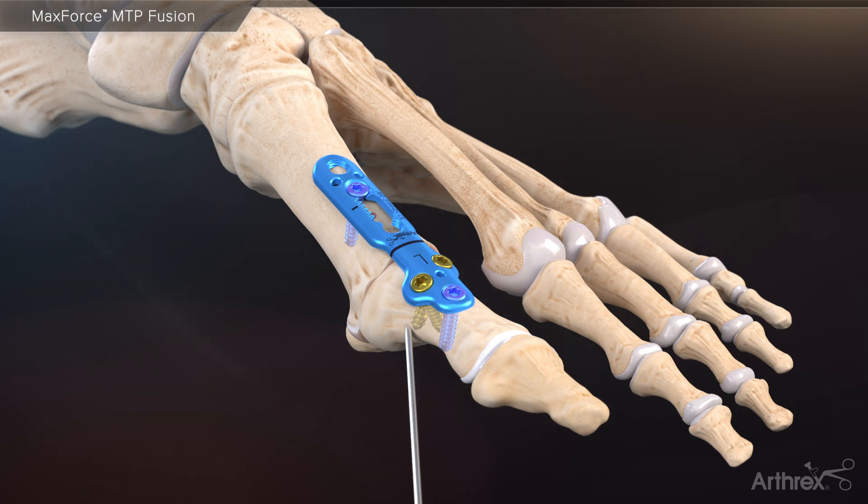At this point, proceed to drill and implant the remaining 3.0 millimeter screws into the metatarsal to complete the plating construct.